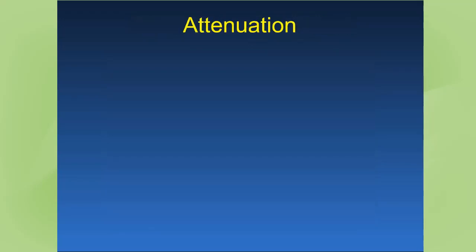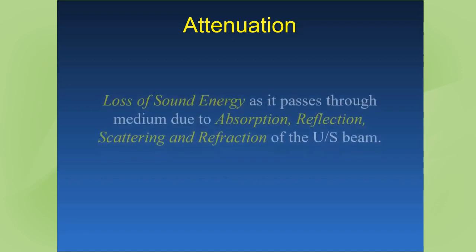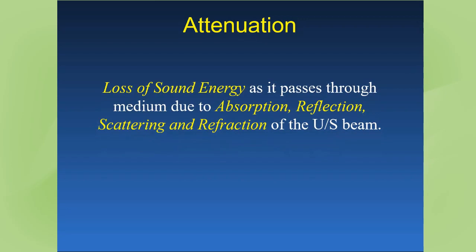All right, moving on to attenuation. This is a word we use all the time, right? We use it sort of intrinsically. We're like, oh yeah, that's attenuated, that's attenuated. I wanted to make sure we knew exactly what this word meant. So attenuation means specifically the loss of energy. And in this case, the loss of sound energy as it passes through a medium.